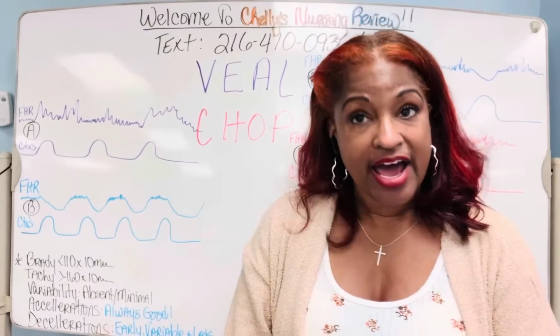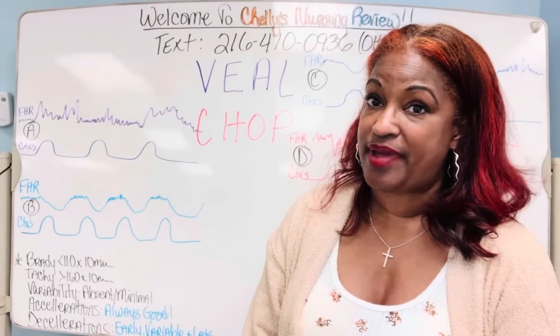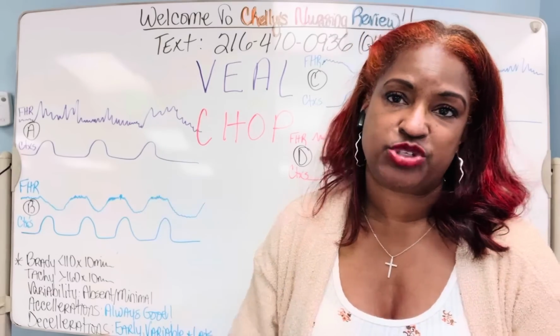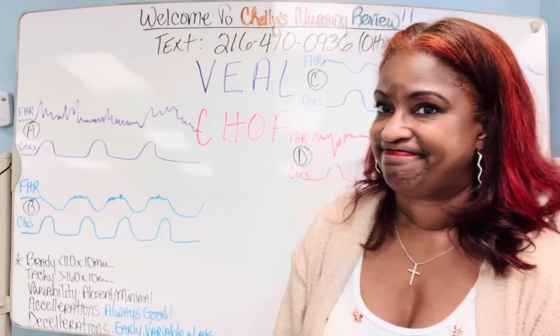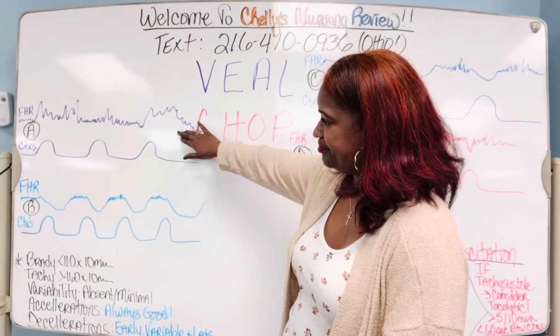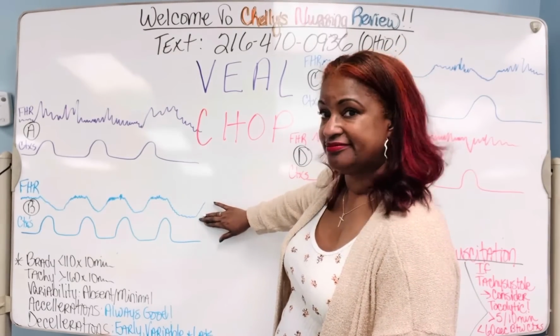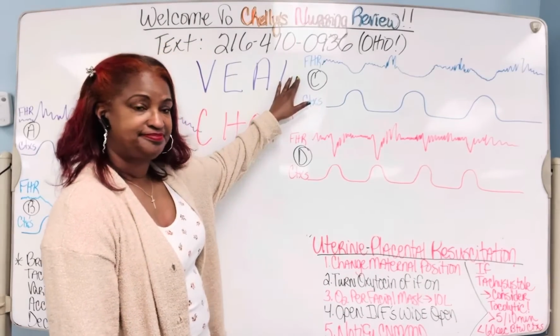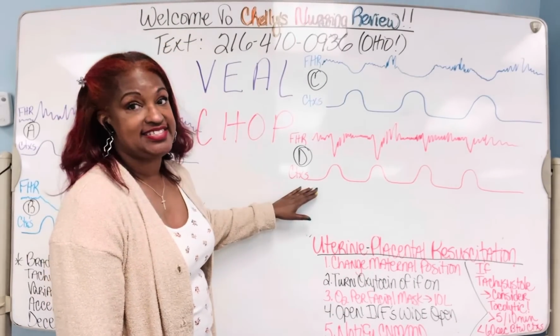Which monitor strip do you anticipate possibly being her fetal heart rate strip during her labor? Is it A? Is it B? Is it C? Or is it D?